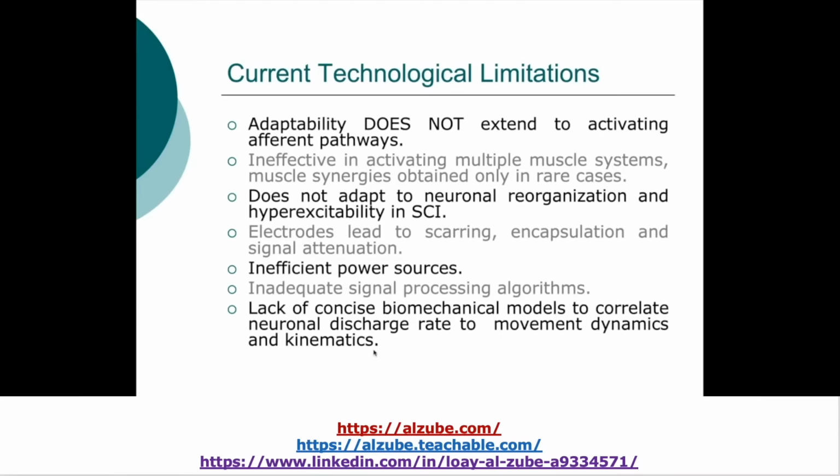For our applications, when we talk about functional electrical stimulation, we have huge databases of EEG signal, let's say, and we would like to look for small patterns to detect movement over the lower extremities or upper extremities. So there's a lot of potential to do this.